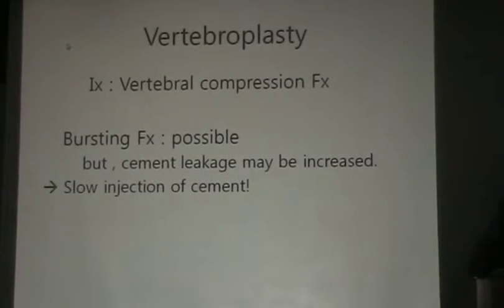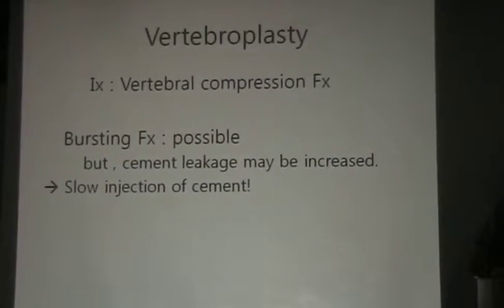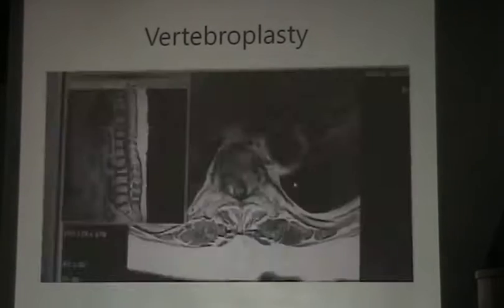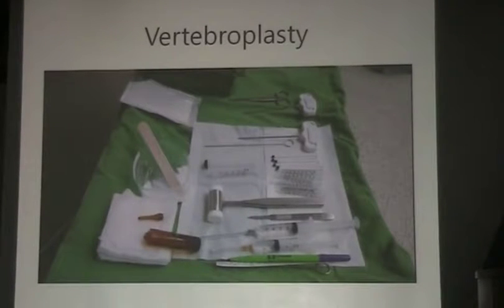Okay, next topic is vertebroplasty. Indication of vertebroplasty is vertebral simple compression fracture. Bursting fracture is possible, but cement leakage may be increased, and so you must inject the cement slowly.